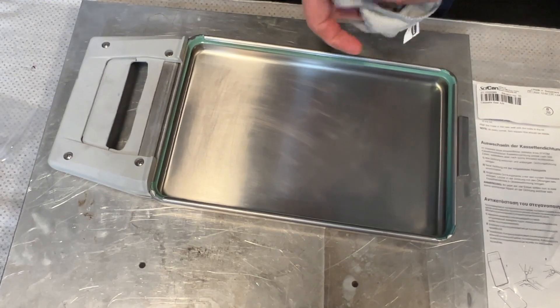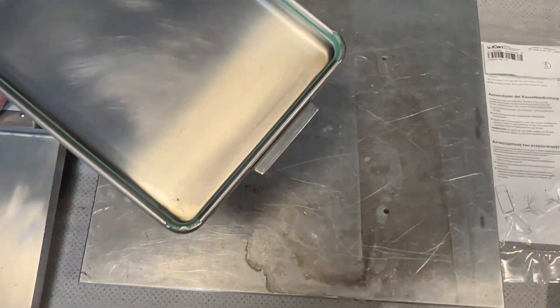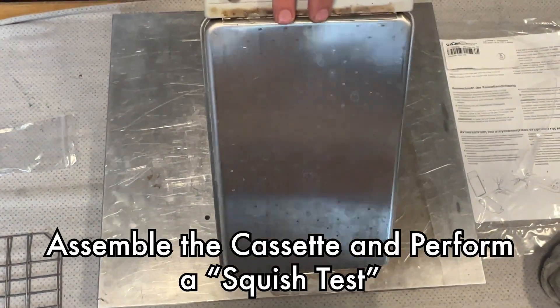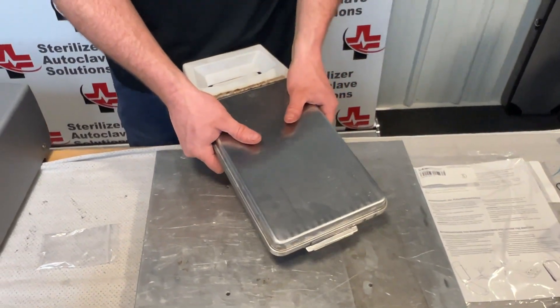After running a cycle, you will notice that water will stay on the lid — that is because of the lubricant. You can use Stat Dry to make that water go away faster. Last thing I am going to do is what is called the squish test. Put the top and bottom together and as you squeeze them together, you should hear a good squish out of the back of the cassette.